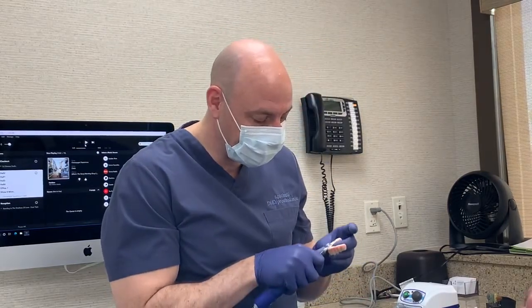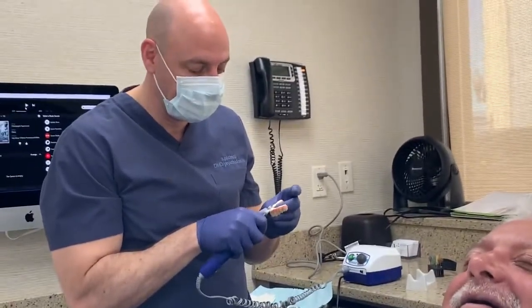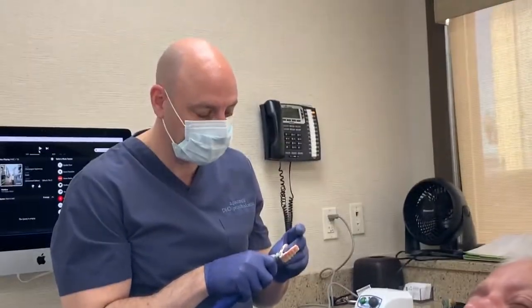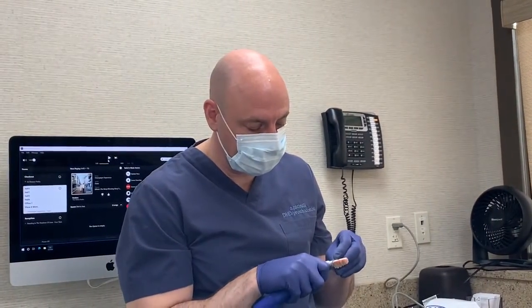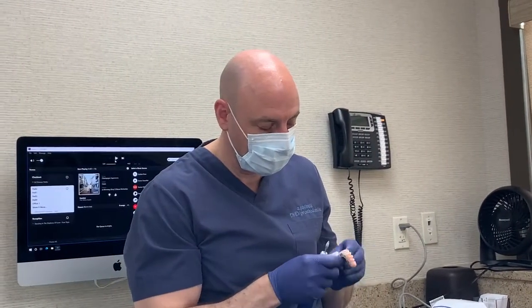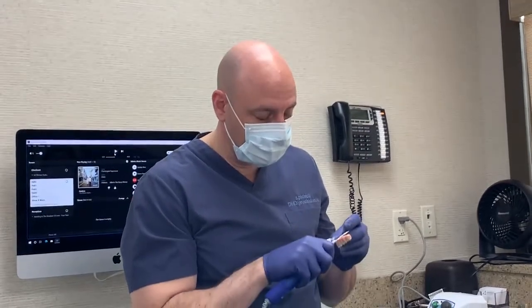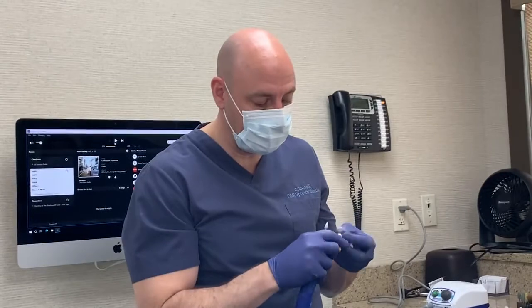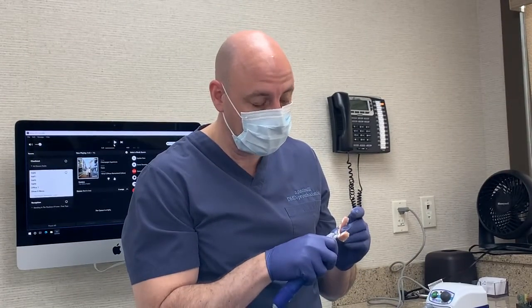I heard you're going to use this material. This is the material you're going to use. So you would use this, for example, on natural teeth on the opposing arch, non-bruxer. Yes, it would be a great candidate. I mean, it's beautiful. It even looks nice if someone was wearing a denture on the lower. Yeah, it'd be totally fine.